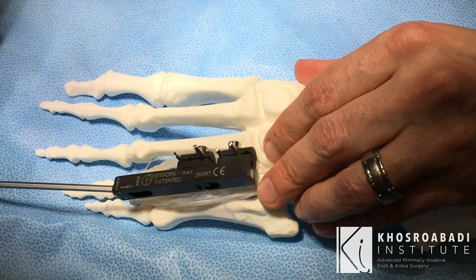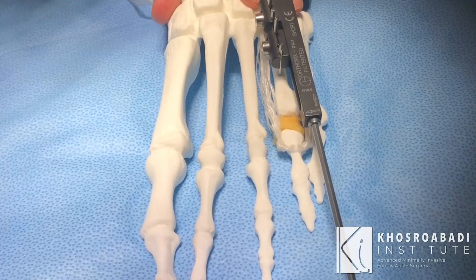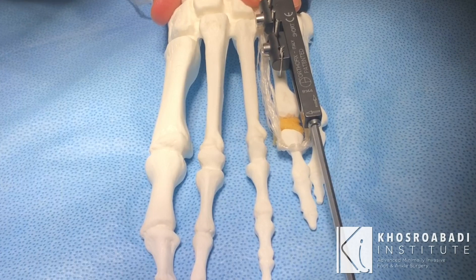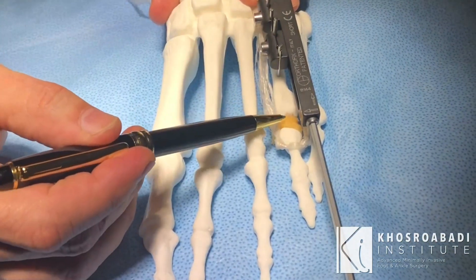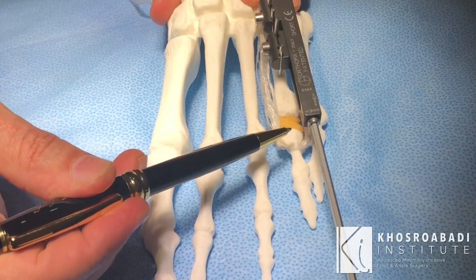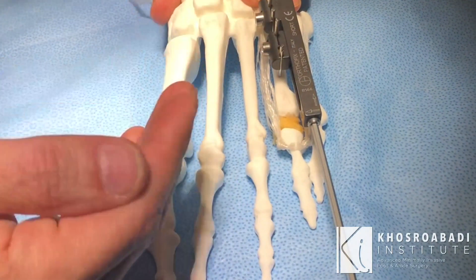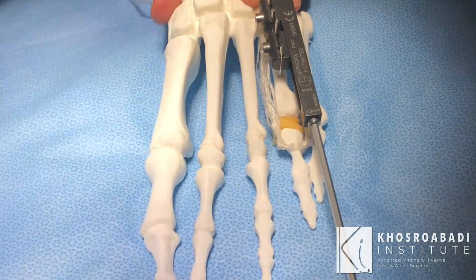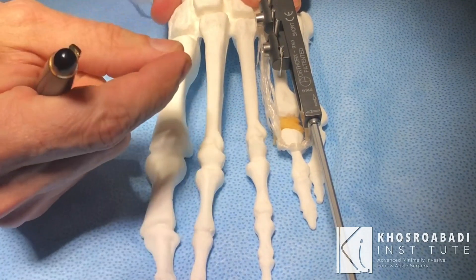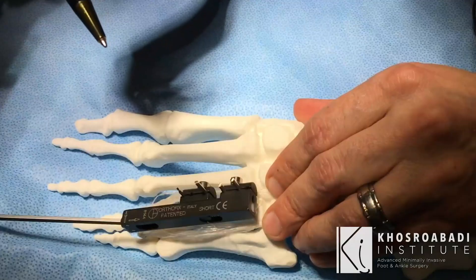As we lengthen the bone — we're doing the same thing, lengthening the metatarsal — you can see what happens to the toe. I want you to look at the joint and see how this toe starts getting subluxed and comes up, because there was nothing holding it. In this situation, we had two different problems: the joint was getting jammed and at the same time the toe was raising up.